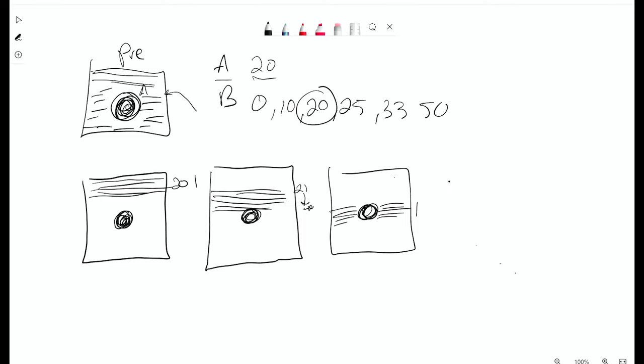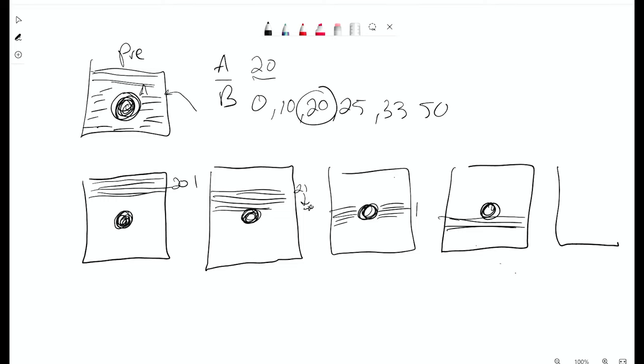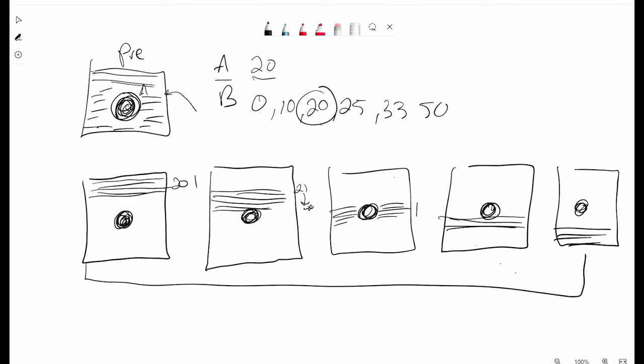Right. So now this next one, I'm filling the center again, and the next fifth, because remember, 20, five times. Right. Do the last one. So in this case, the temporal footprint is from here to here, because if the patient screws up on any of these phases, it's going to make your image blurry.